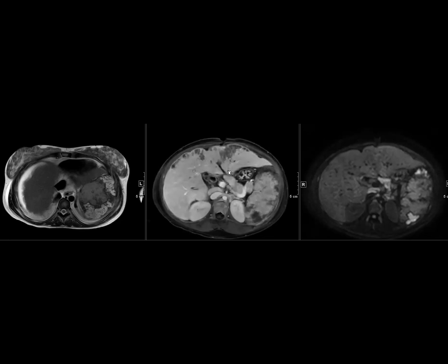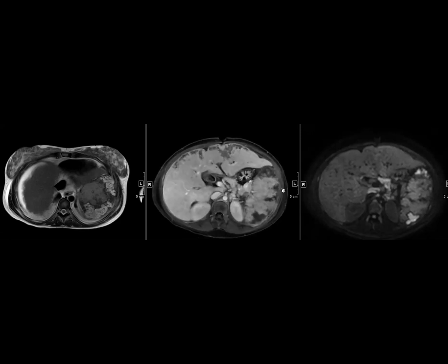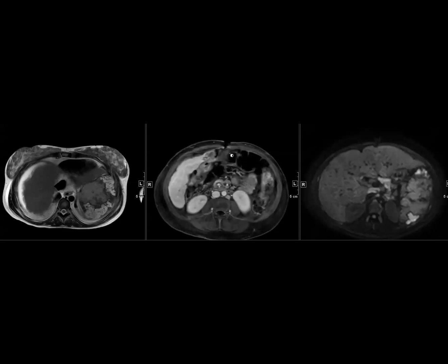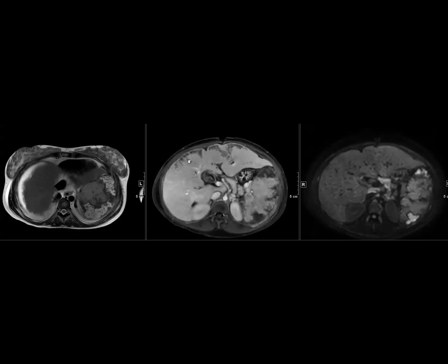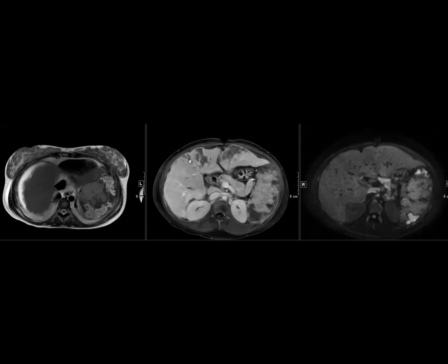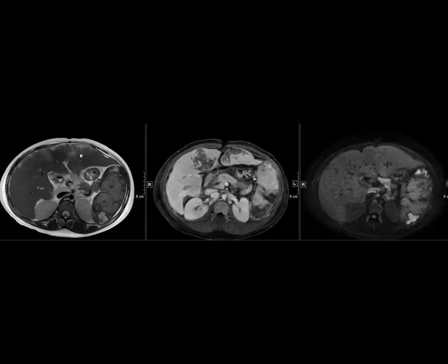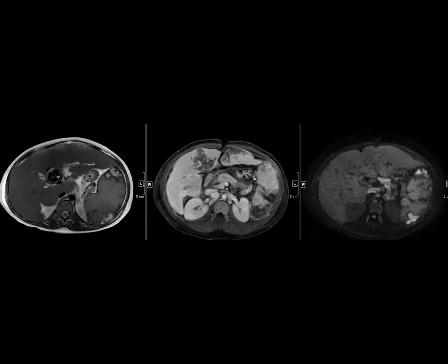Could it be sickle cell? That's right. She's a sickler. For whatever reason, her spleen didn't auto-infarct yet, so she still has a big spleen with infarctions. So this is infarct related to sickling of her blood vessels, and all the tiny venules and sinusoids in the liver get blocked off. So infarcts of the liver are not common, but they can happen. And if you look carefully, it makes sense, right? The capsule enhancement is preserved, and if you forget that this is liver, the appearance looks very similar to what we see in a spleen. And then of course she has these huge biliary calculi, as patients with sickle cell can develop.